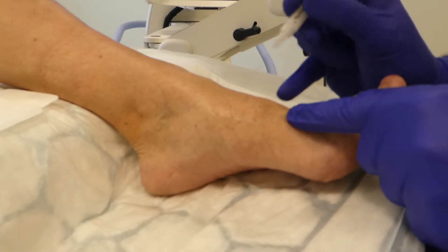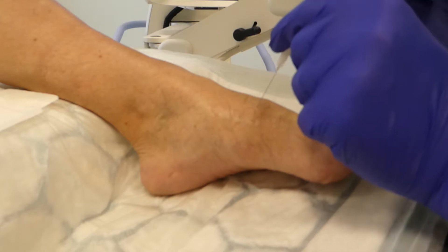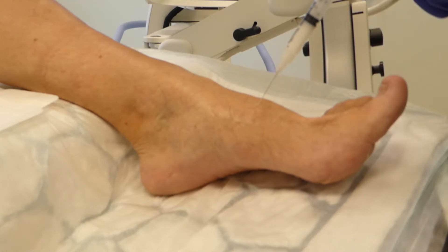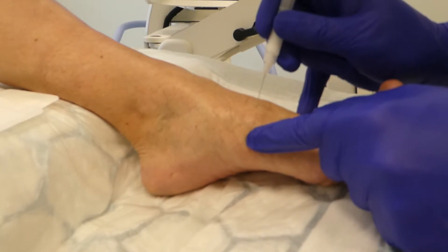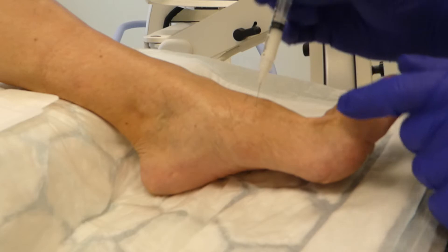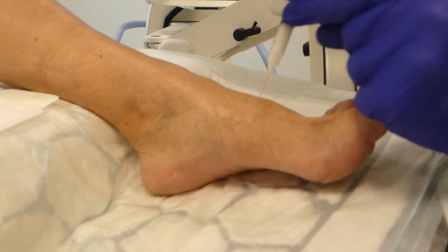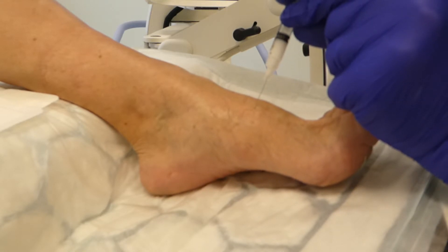Okay Pat, little scratch coming up — three, two, one, out. So what I'm doing is a little check X-ray and we are very, very close in there. I'm going to see if I can just really get that in — it just went right into the joint. I've got needle placement; just going to bring it out a little bit, and that's into the joint there. Pat, that might sting a little as it goes in — how's that feel? Yeah, it's a bit tender.